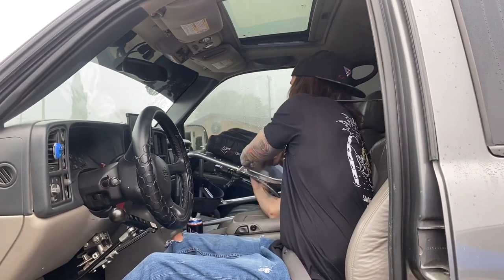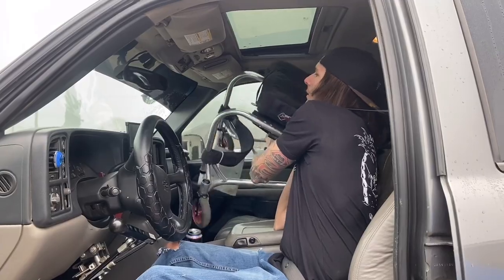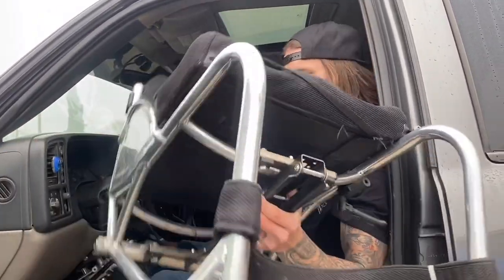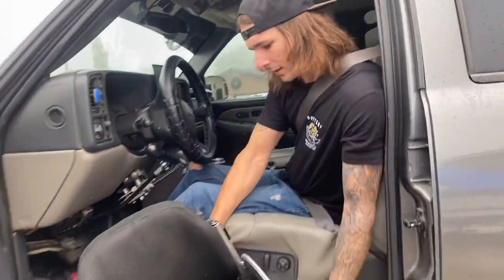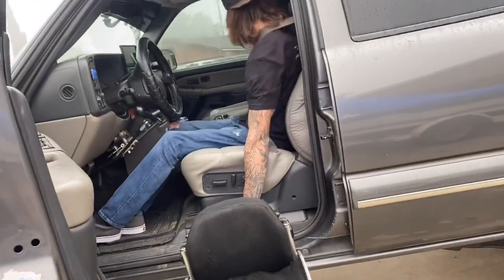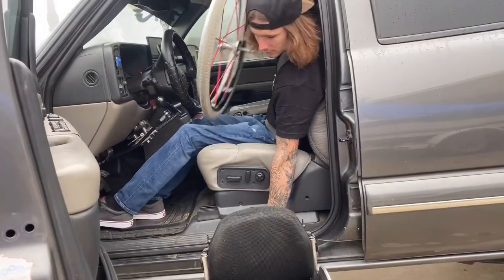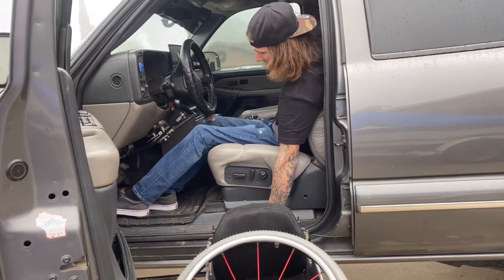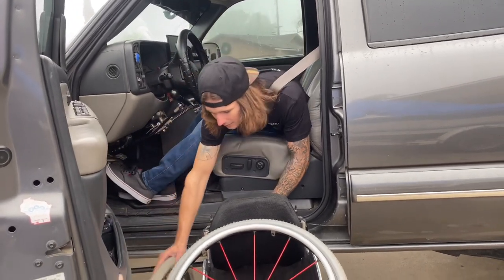Start by grabbing the wheelchair — try to hit as few things as possible. I'll put it all the way on the ground and hold the back of it. There are a lot of different ways to do this; this is just the way I like to do it.